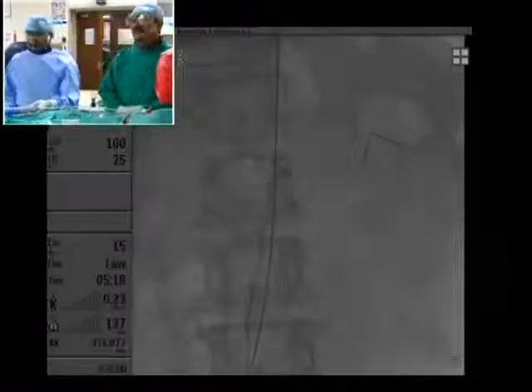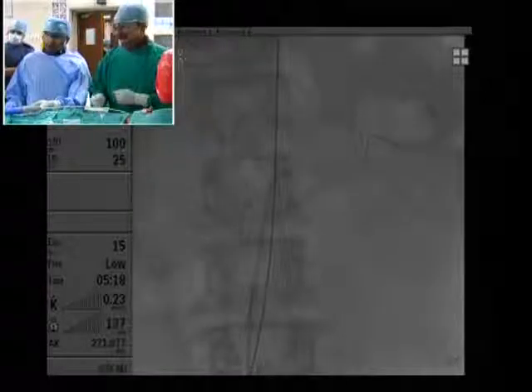The next angio. In this image you're seeing, as I said earlier, I'm marking the left renal artery with a right Judkins catheter, and I've left a roadrunner wire within it. This will tell me where the renal is. I can test and be sure that I'm deploying the device at the right level. Too high is bad because you'd be occluding the renal. Too low is also not good because you're losing some neck. Okay, so here we go.